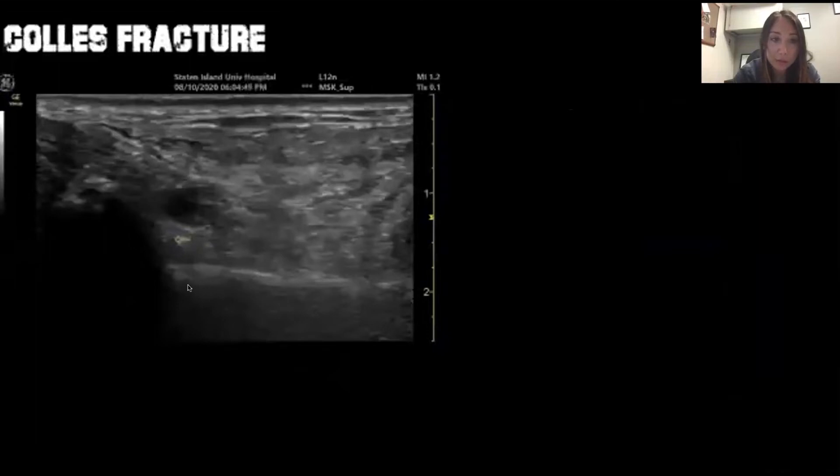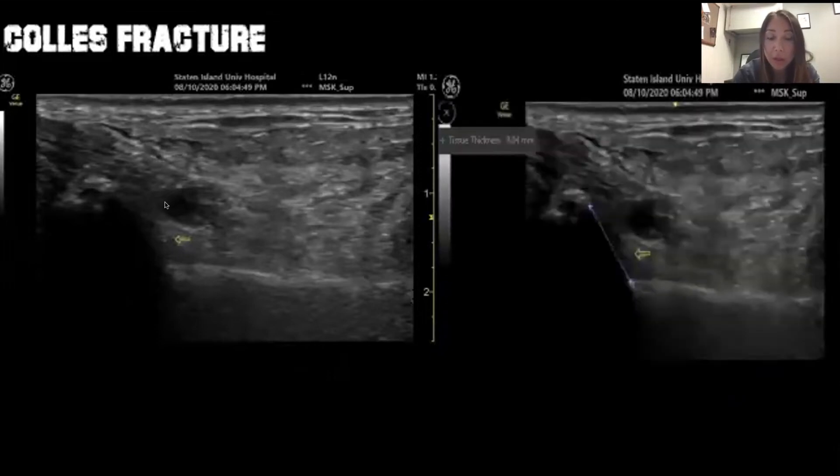Here's another example on ultrasound. You can see that bones appear hyper-echoic, and you can see the separation between the bones. You can actually measure how displaced it is — when we measured it, it was about 9 millimeters displaced.